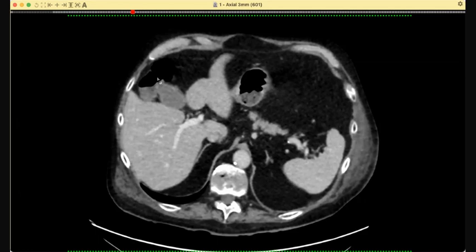Now, what happened was that the patient developed abnormal blood culture with signs of infection. They did a urine culture, which was normal. So there is infection going on. Microbiologists have advised imaging. They want us to tell them what is the source of infection. Over to you. You have to tell the source of infection to the microbiologist. Okay, I will request for the remote.